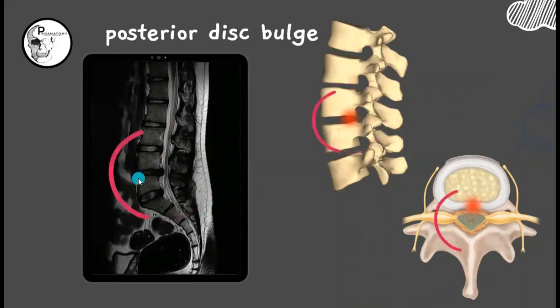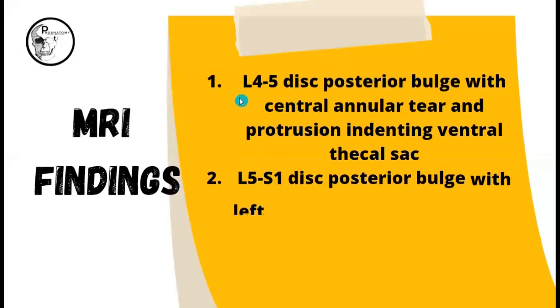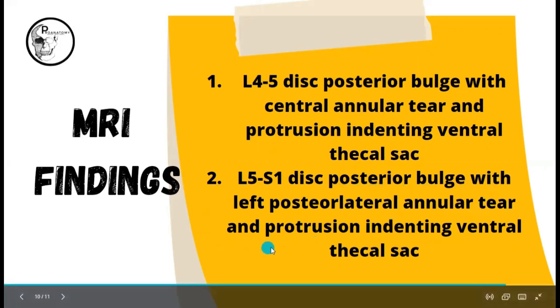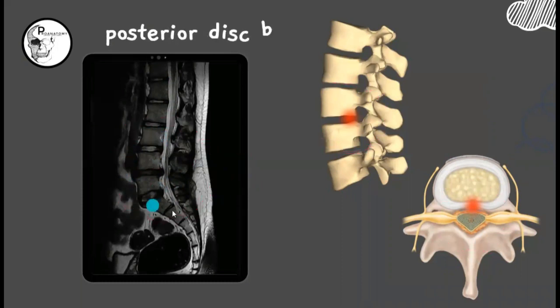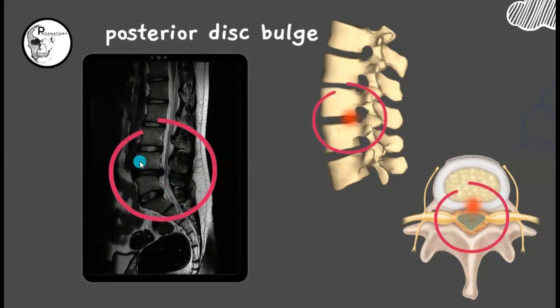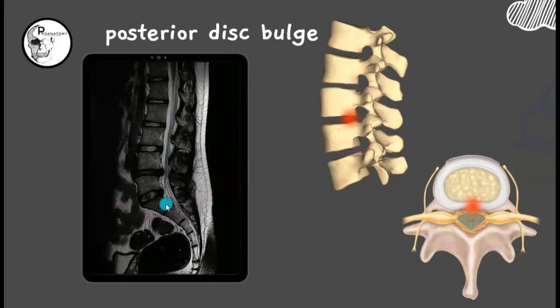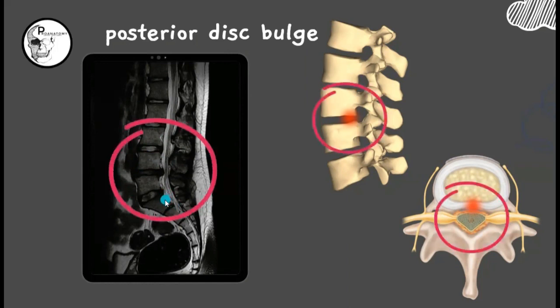The MRI report for the lumbar region reads: L4-L5 disc shows posterior disc bulge with central annular tear and protrusion indenting the ventral thecal sac, and L5-S1 disc shows posterior bulge with left posterolateral annular tear and protrusion indenting the ventral thecal sac. Looking back at the MRI, at the L4-L5 level you can find posterior disc protrusion indenting the ventral thecal sac and causing a small stenosis of the spinal canal. These are the key findings to consider when observing an MRI to arrive at the diagnosis. This concludes today's session. Thank you.